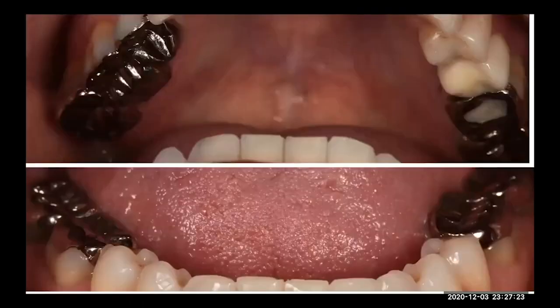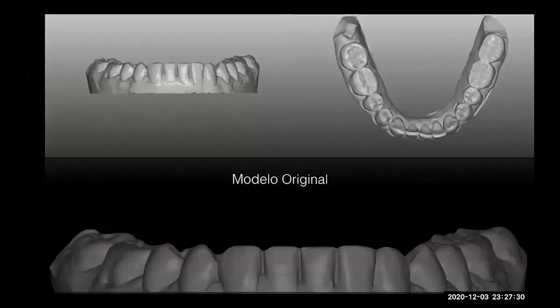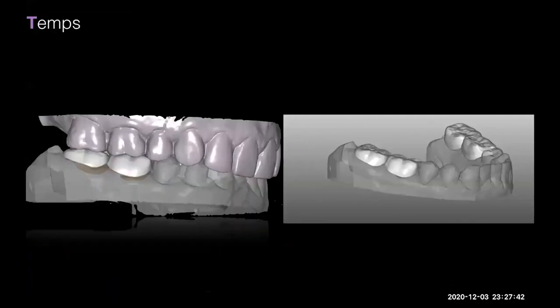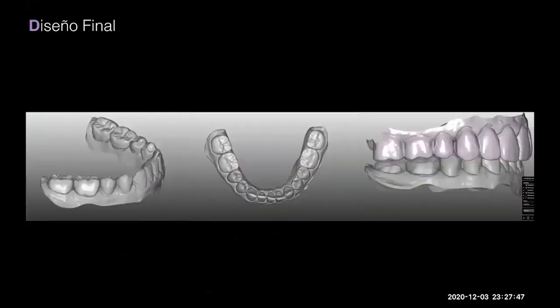The treatment here is to remove the gold restorations and try to compensate a little bit the curve of Spee. So we start doing something in the posteriors, in the lower posteriors. We did the eggshell design to create the posterior crowns. We did the design, then we did the preparations and took the intraoral impression with the scanner, with the iTero scanner.